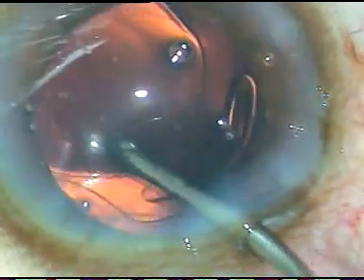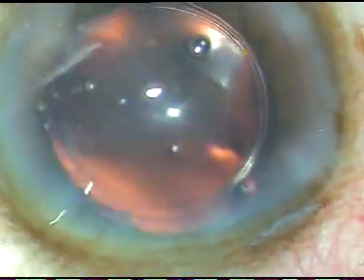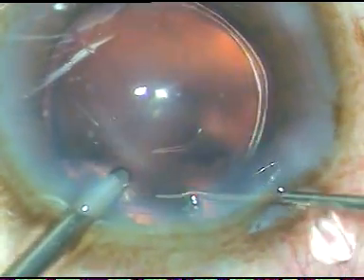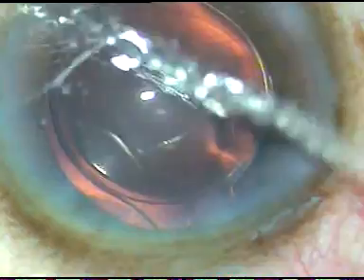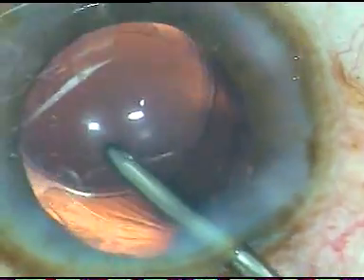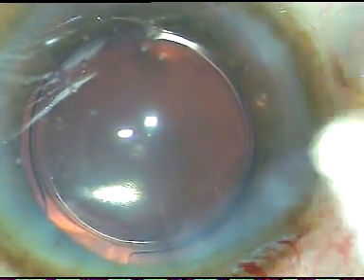That's it. The intraocular lens has been placed in the capsular bag. Under irrigation, and now I am checking whether the lens is actually in the bag or not. Yes, it is there in the capsular bag. Now I am happy, and I am about to complete the case.